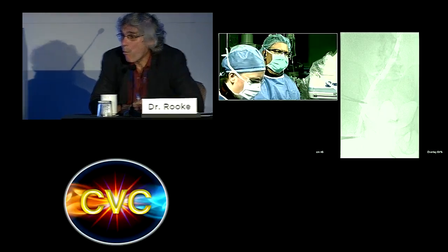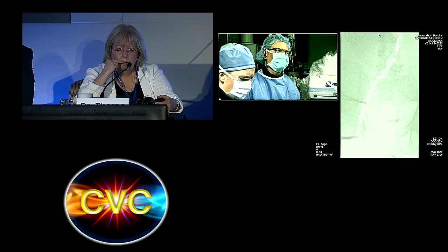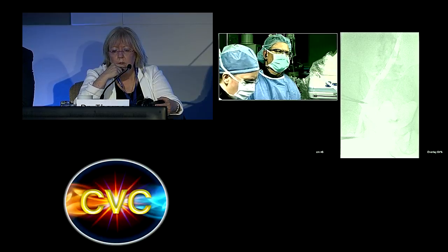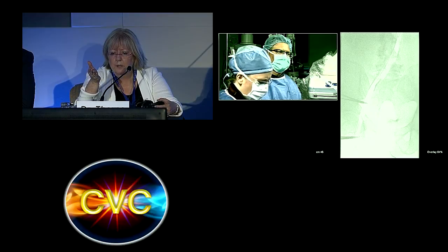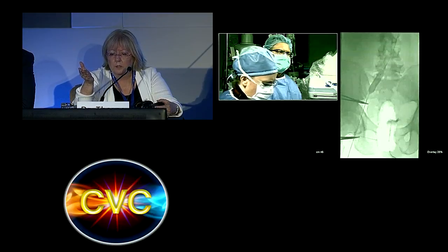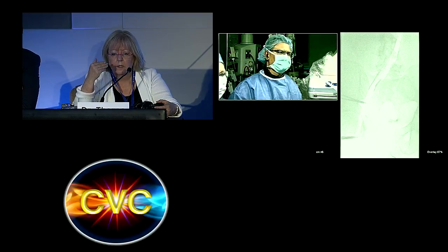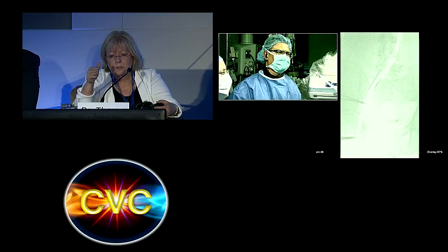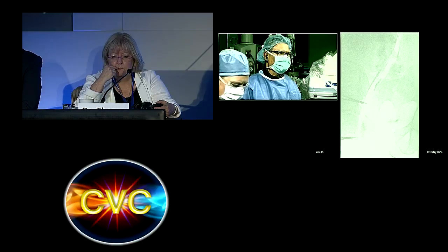Yeah, well, I heard you say that you will stent everything. You mean from the external iliac down, or including the common iliac? I would go, personally, because of that hang-up of contrast, which I don't think is a good sign. There are two ways. You can let him go and see how he does, and if he heals, it's great. Otherwise, if it's hanging up there, it's not a good sign to have the contrast not go through there quickly. I would stent all the way up to the cava. All right, well, let's see what the venogram shows after this dilatation. I can see there was something there, definitely.